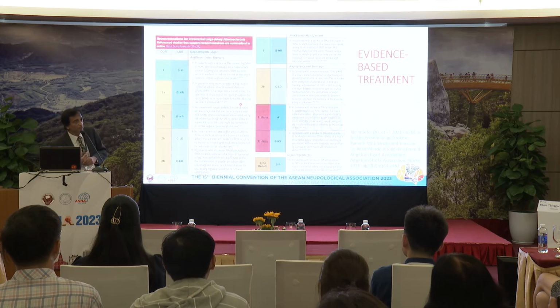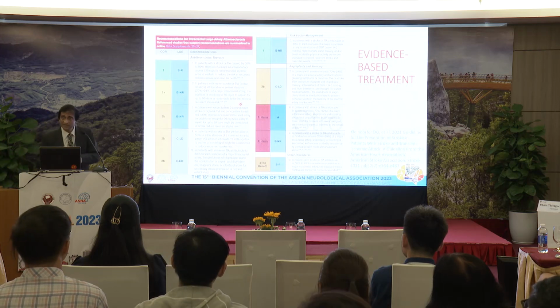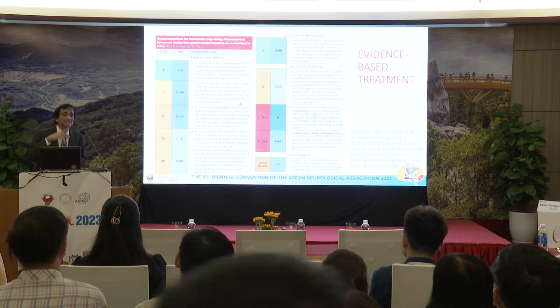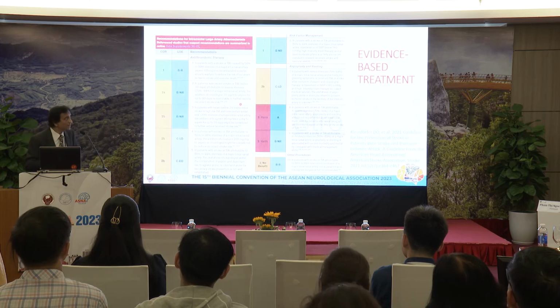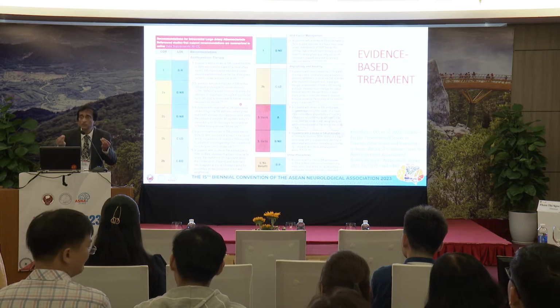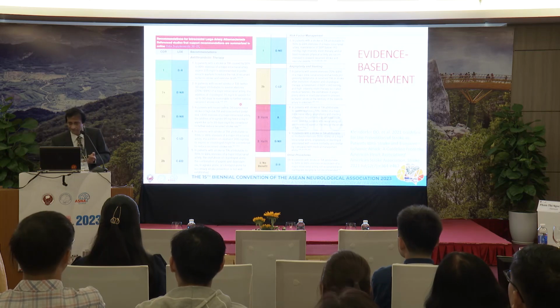There are some studies showing if you see multiple emboli, some even give anticoagulants to reduce emboli detection. High dose statin, so it does change your treatment. So it's important to find the stenosis. I predict in a few years from now, we'll be stenting these arteries. Vietnam is fantastic. You do a lot of very good stenting work here, carotids, and I think intracranial too. I think it'll come in the years to come. Even here, like the cardiologist, will now be stenting the brain. And in your hands is the tool to detect the stenosis safely and non-invasively.